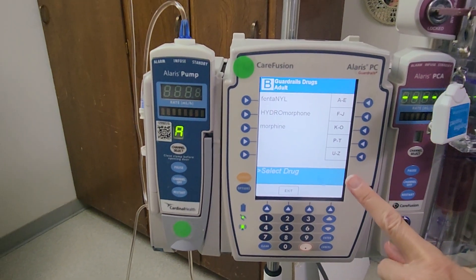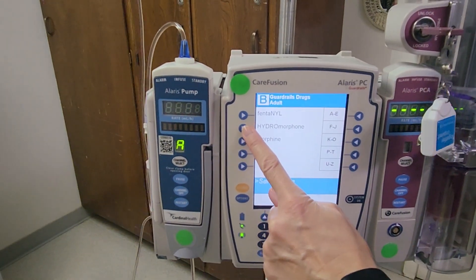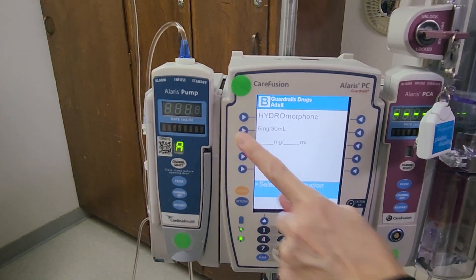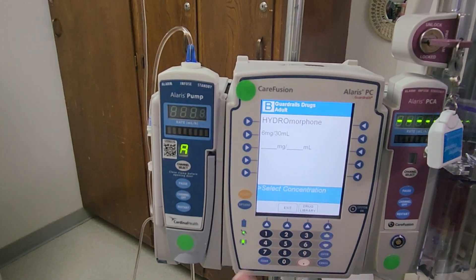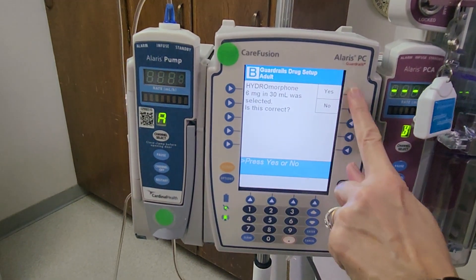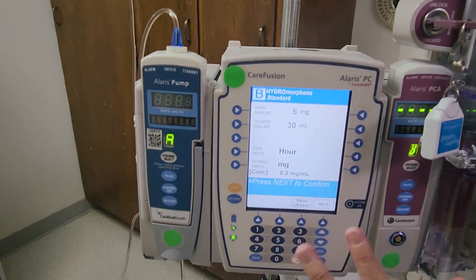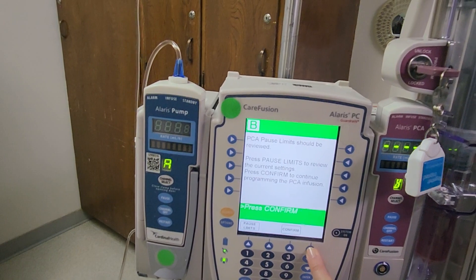Now we're checking our orders with our second RN. In this case, our order is for hydromorphone and our order is for standard. Your concentration should be listed, but you want to double check. In this case, our order is for six milligrams per 30 mLs. You will be entering the orders that you have for your patient. Press next to confirm.